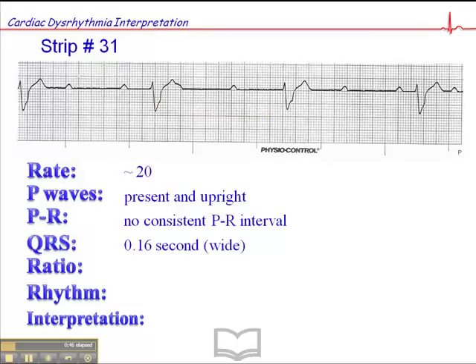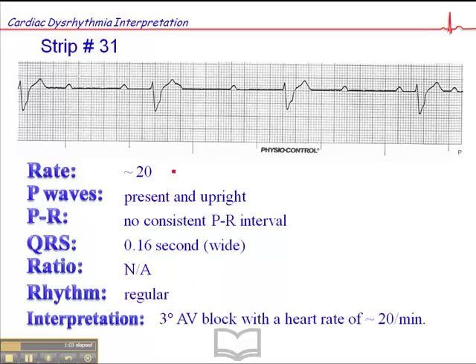If we continue on, the QRS is wide, and that's consistent with a third degree AV block. The ratio is not applicable. The rhythm is regular, which suggests that these QRS complexes are coming from a single focus — consistent with a third degree AV block. And the rhythm is, in fact, a third degree AV block with a heart rate of 20 to 25 beats per minute.